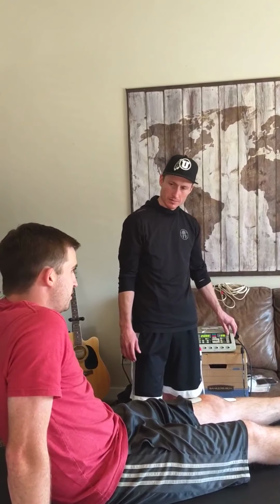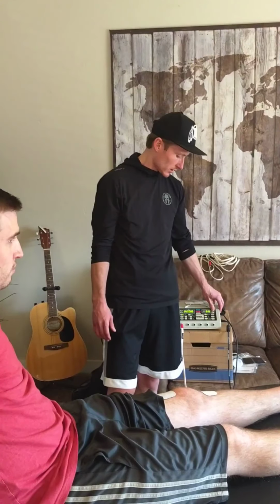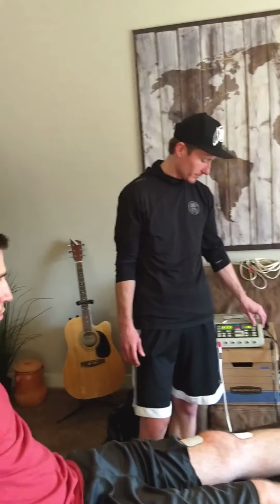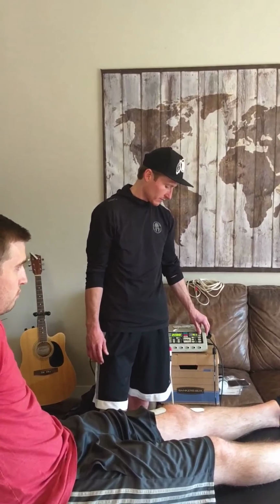Starting to feel more. Now? Yeah. All right. Great. Okay, so yeah, you let me know when it's strong but not uncomfortable for you. Okay. Still doing okay? Yeah, right about there. Right there? Yeah.